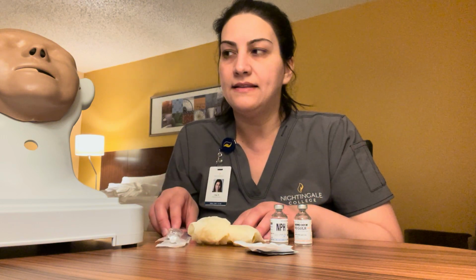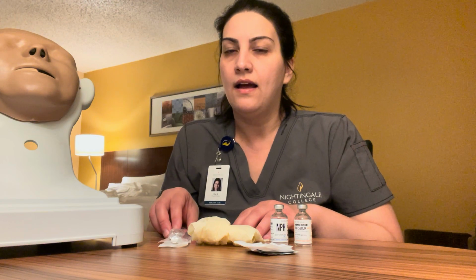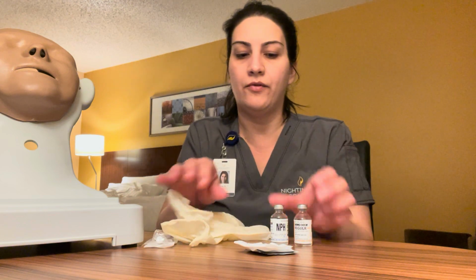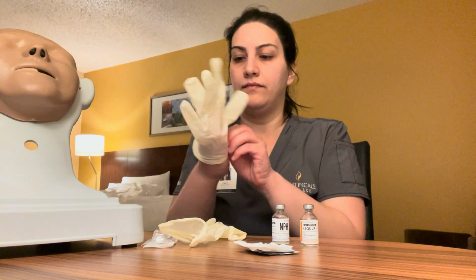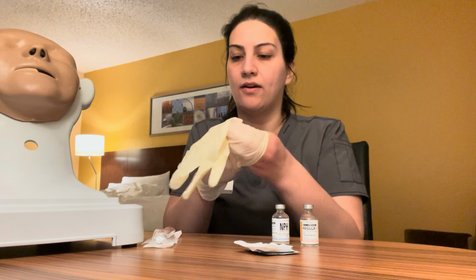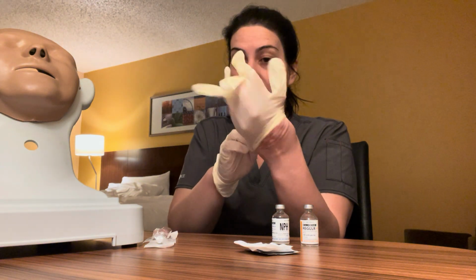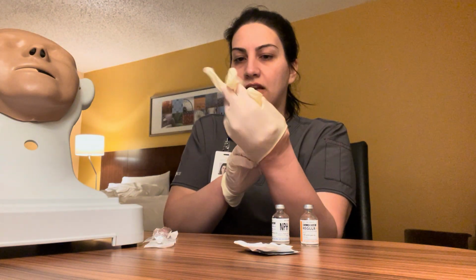Next, I'm going to go ahead and take my patient's glucose levels, and I'm going to determine the next meal. And I'm going to go ahead and do hand hygiene here and put on my clean gloves. And I'm going to verify the 3rd time against MAR. Hand hygiene, put my clean gloves on, and we're going to get started. So Mrs. Smith, I just want to let you know also, upon injection, you might feel a little bit of stinging and burning. That is normal when you get an injection.